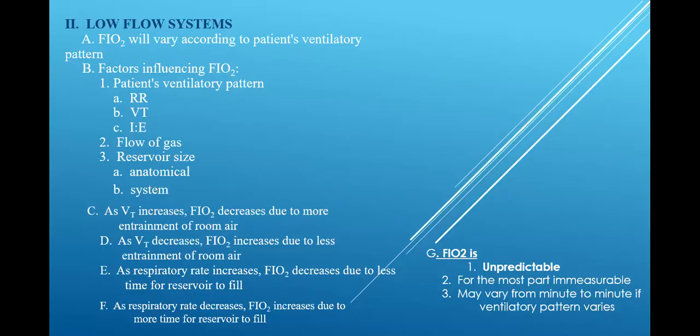Okay. So respiratory rate has to do with the reservoir. If you want to think of F and F, that's fine. My respiratory rate will affect my FiO2 because of my reservoir filling time. So as my respiratory rate increases, my FiO2 will go down because of less time to fill.